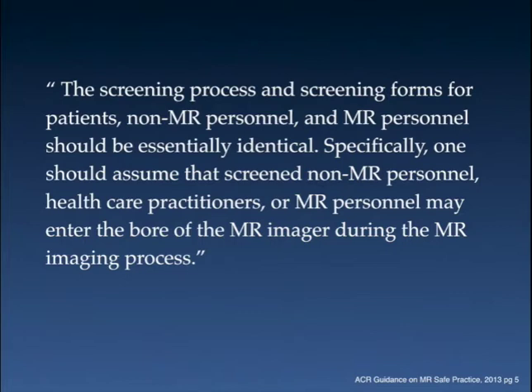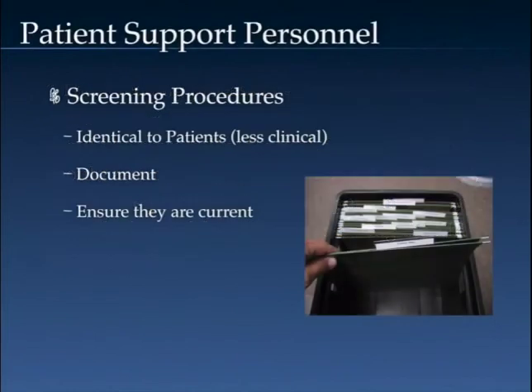Now, with regard specifically to patient support personnel, for example, nursing personnel, anesthesiology, respiratory therapy, that sort of job function, again, these should be identical to patients. They just don't need any of the clinical symptoms. For example, what leg is your pain in? How long have you been having headaches? That sort of thing. But everything else needs to be identical, and it needs to be documented.